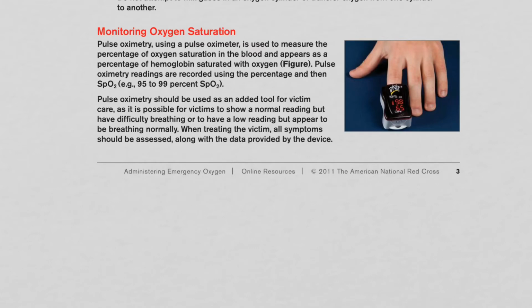Most clinics will have what is called a pulse oximetry system. If not, you can order them for relatively cheap. These help you determine whether or not oxygen actually needs to be administered. But the awesome thing is, as oxygen is being administered, it allows you to look at the concentration of oxygen as you are delivering. So you'll start to see that 98%, it might actually increase, and then it will allow you to decide when you need to stop treatment, if that makes sense.